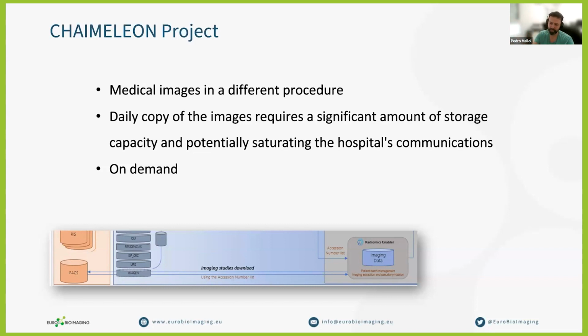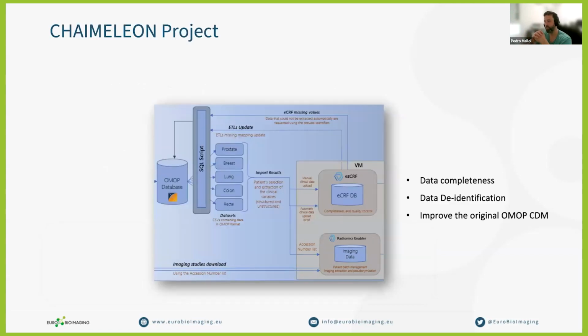So as you can imagine, in the PACS system, I still have the open data. That means I still have the names and some sensitive data that I need to delete, or I need to hash, or I need to do something. So within this process, I will pseudonymize the data or anonymize, depending. And we need to make sure that we are pseudonymizing in the same way that we pseudonymize the clinical data, because we need to link the clinical data with those images. And this is what we have at the end. We have the clinical data and the imaging data, all pseudonymized.